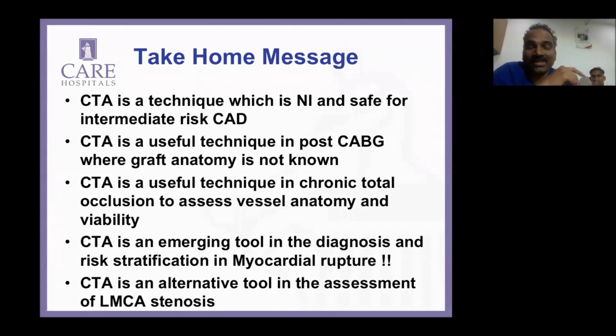See, many times we start a CTO with a Fielder wire, but in cases where I see calcium in the middle of the lesion, in the plaque and not in the walls, my Fielder never worked. So almost all the time I end up with either a Gaia 2, Gaia 3, or Conquest.